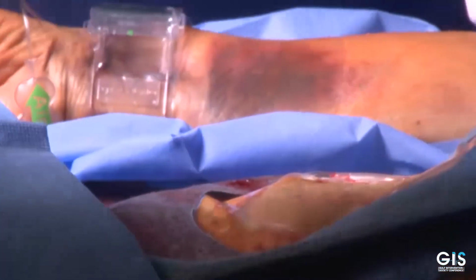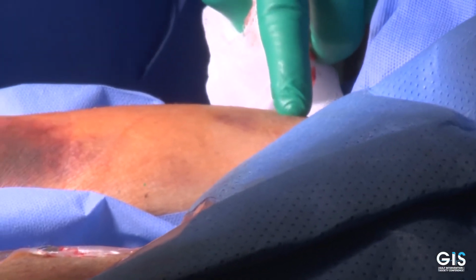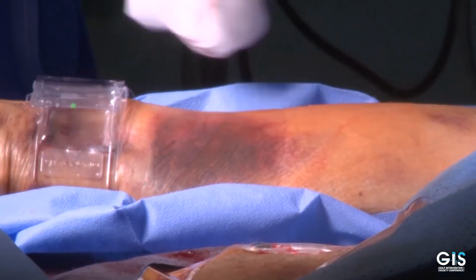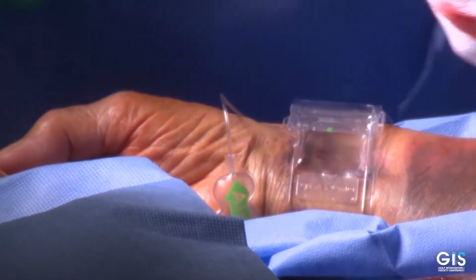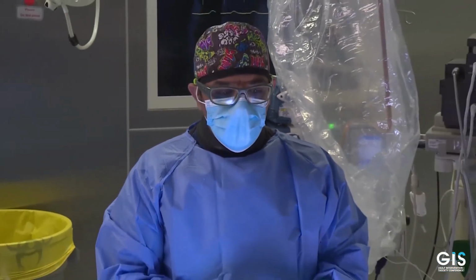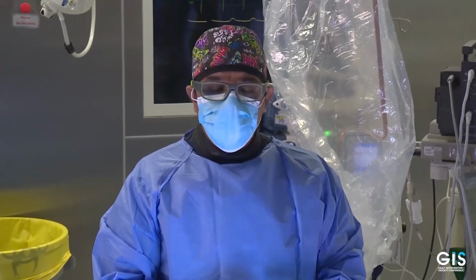This is our access site here for the 6 French venous sheath that we put here. It's a radial size French sheath that we use for the pacemaker placement across the antecubital vein. And this was our radial access, 6 French, for the Sentinel device that we used. And as you can see, this patient is going to the recovery room completely delined. There are no lines remaining, and that will enhance and encourage early discharge and early recovery for those patients.